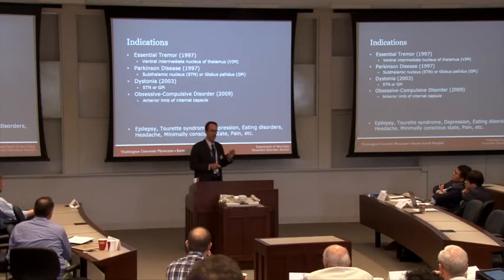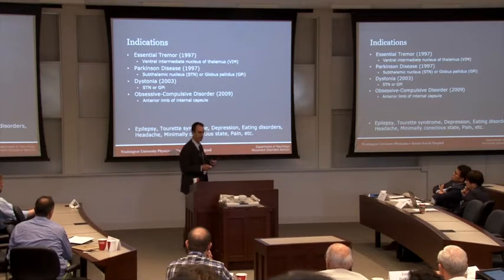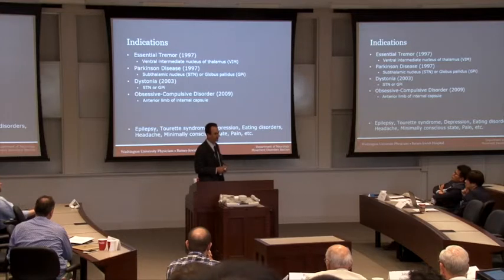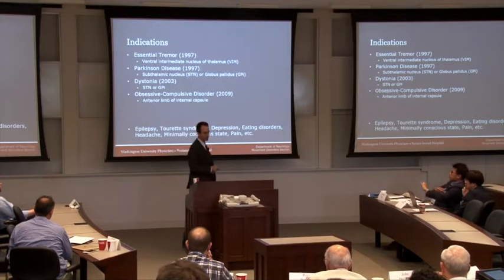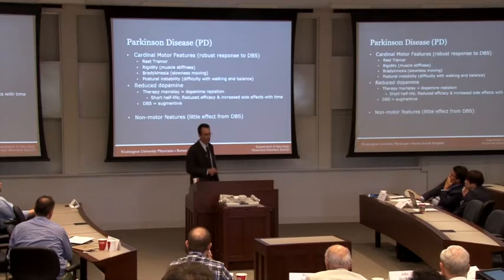Thinking about this as a network disorder treated at a single point of stimulation is an interesting concept, and I'll get to that a little bit. And then obsessive compulsive disorder, a very different disorder, a psychiatric disorder where very severe cases respond to DBS. And there's this whole slew of literature now, phase 1, phase 2 trials on various disease states where DBS has shown some promise.